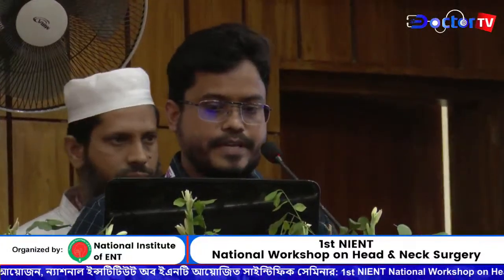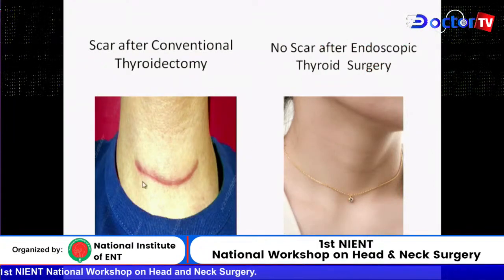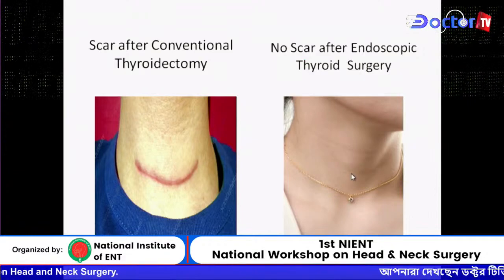My presentation is on a very promising and attractive topic: transoral thyroidectomy, a novel endoscopic surgery in Bangladesh. And this is the scar after conventional surgery. And see the picture of the neck after endoscopic thyroid surgery.